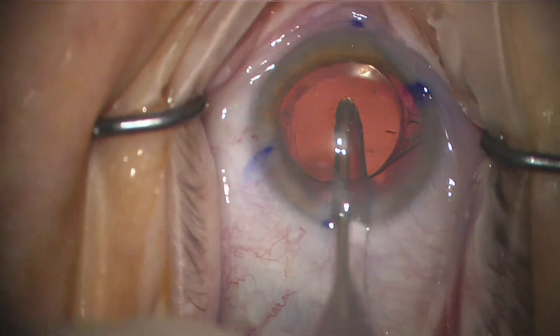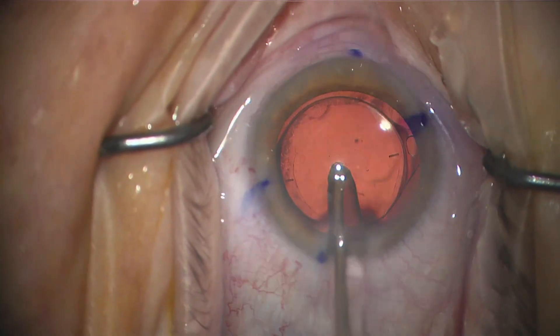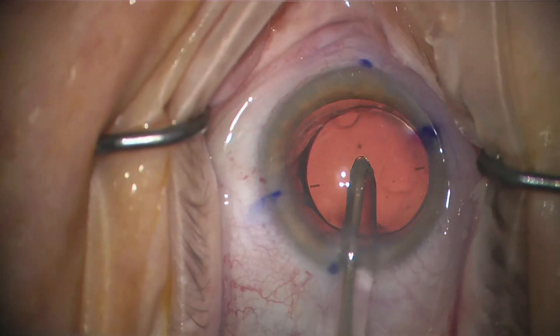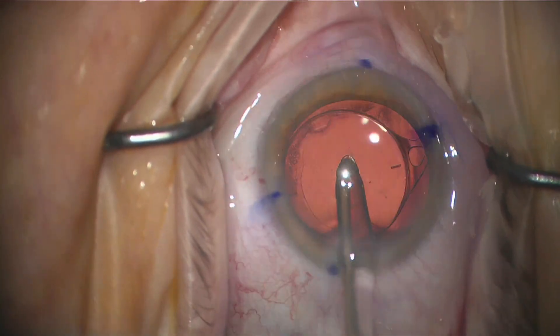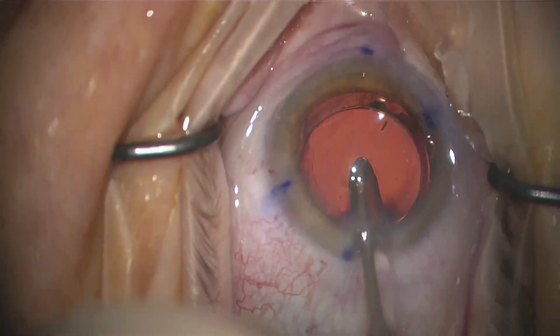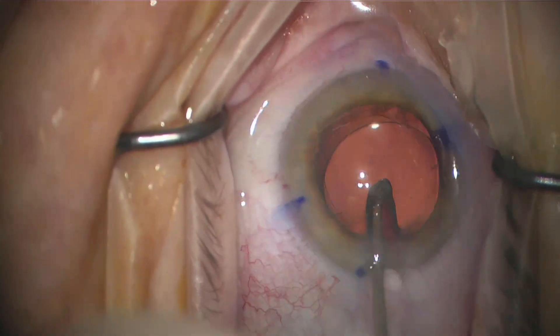It goes back and forth, and that way I can move the lens in either direction I want and align it exactly where I need to with the marks for my toric or astigmatism lens. This happens to be an MX60E Invista lens, and you can see the markers. You can see that it rotates very quickly with just a few rotations of the IA tip.